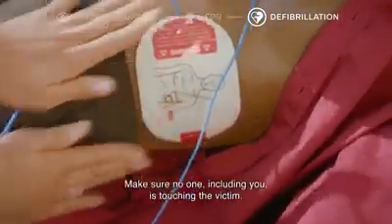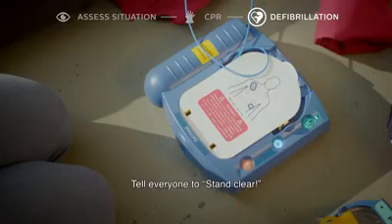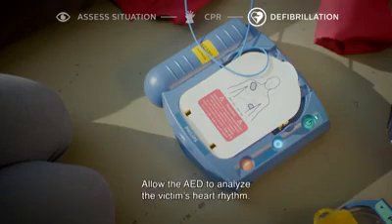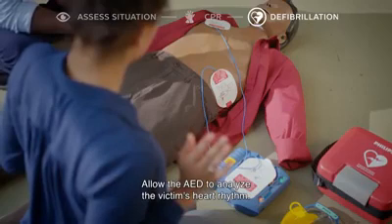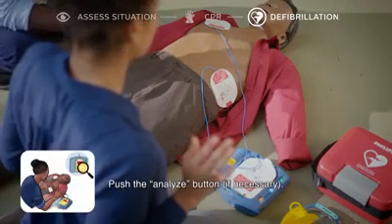Make sure no one, including you, is touching the victim. Tell everyone to stand clear. Allow the AED to analyze the victim's heart rhythm. Push the Analyze button if necessary.